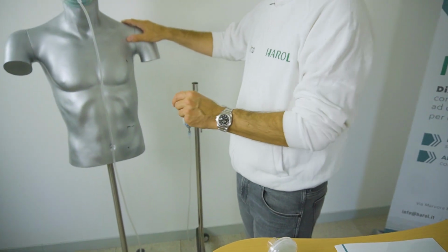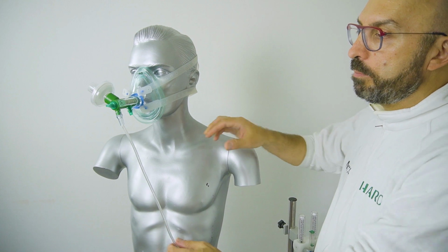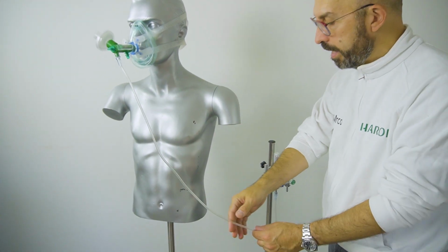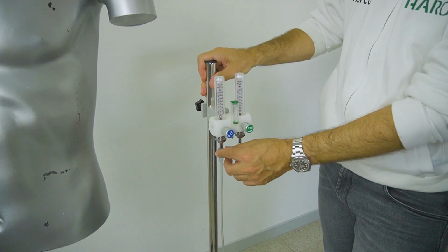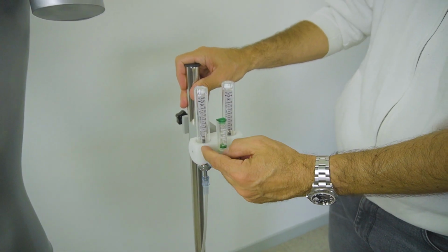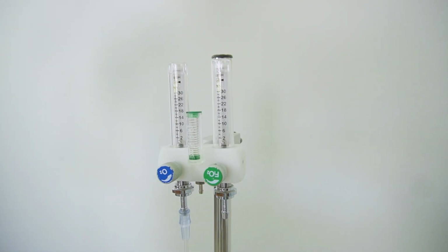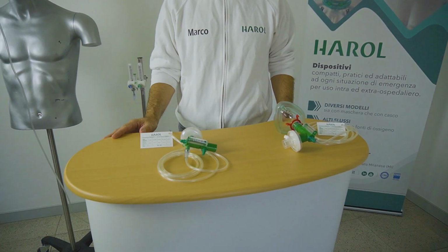Let's see the device worn by the patient. There's a single oxygen line that must be connected to a 15 liters per minute flow meter. After opening the flow meter, depending on the extent of the flow provided to the patient, a virtual PEEP is formed. It's a really simple device to use.